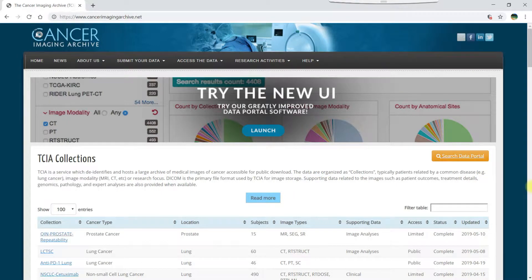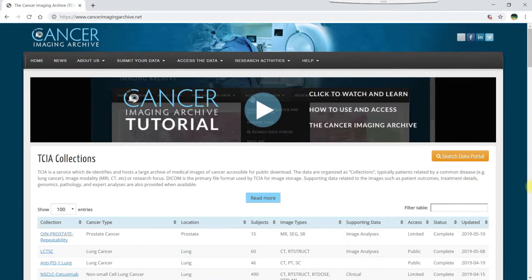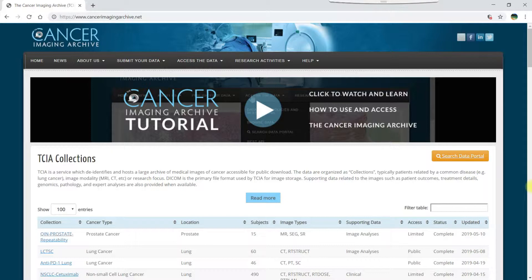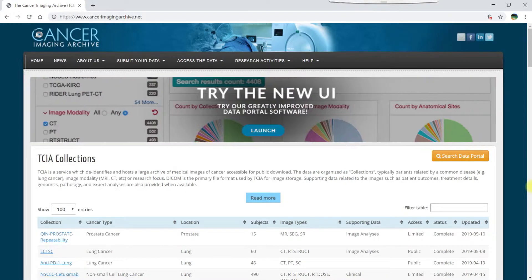Welcome to this video tutorial on how to search for DICOM data in the TCIA data portal. Let's start on the TCIA homepage at cancerimagingarchive.net.